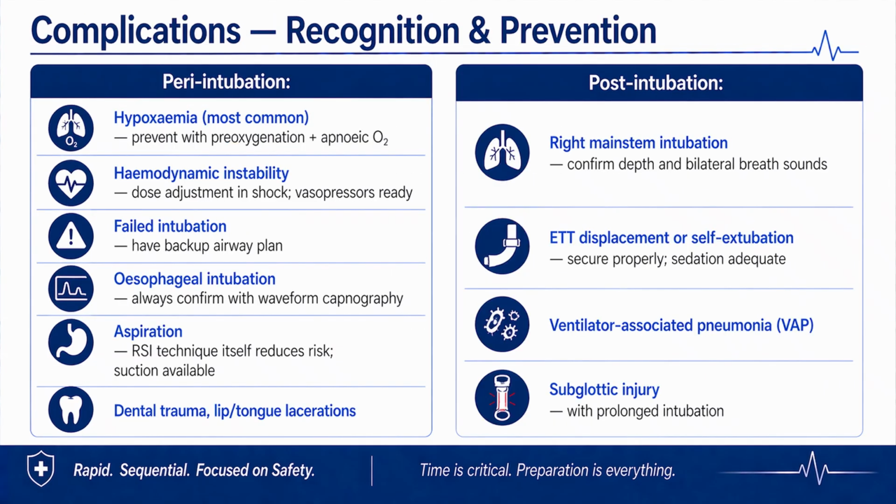Just like any other procedure, RSI is associated with complications which may occur during, before, or after intubation. Common complications include hypoxia, hypotension, aspiration, esophageal intubation, pneumothorax, dental or other soft tissue trauma. Most of these complications are preventable through proper planning and practice.